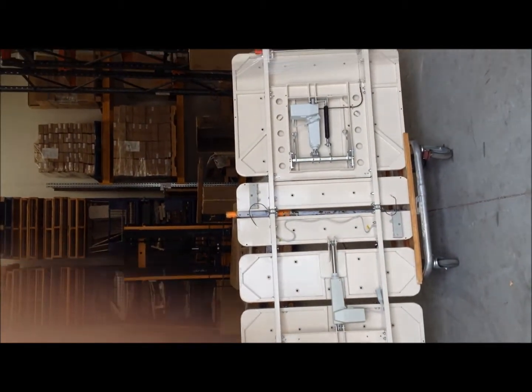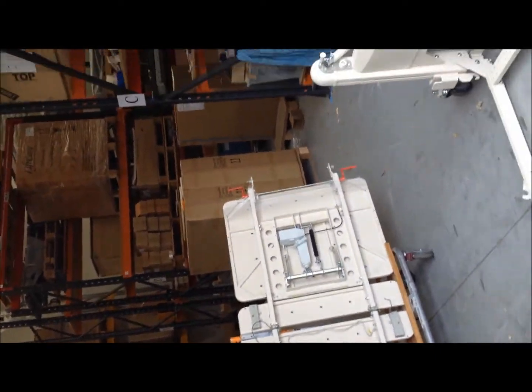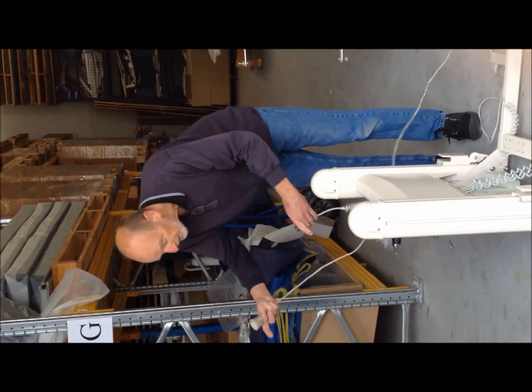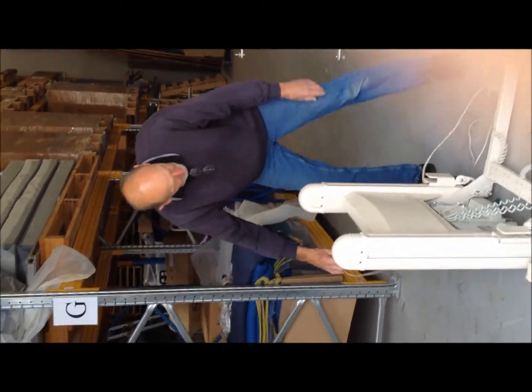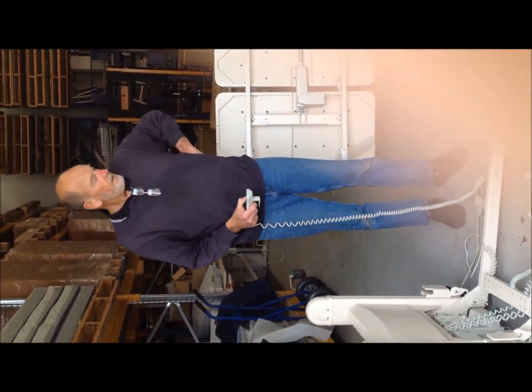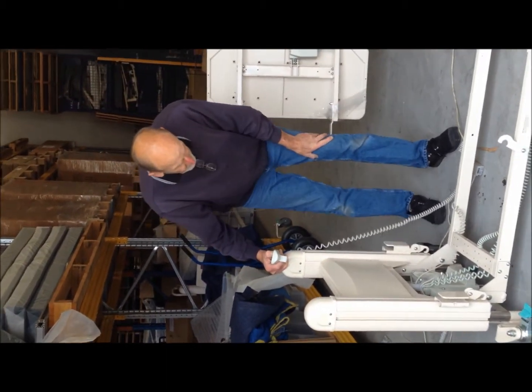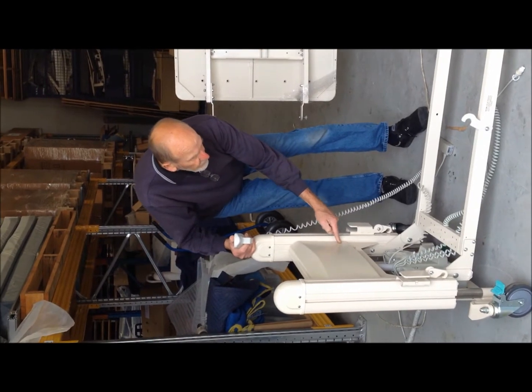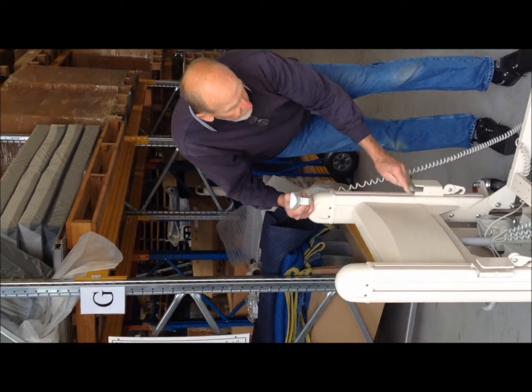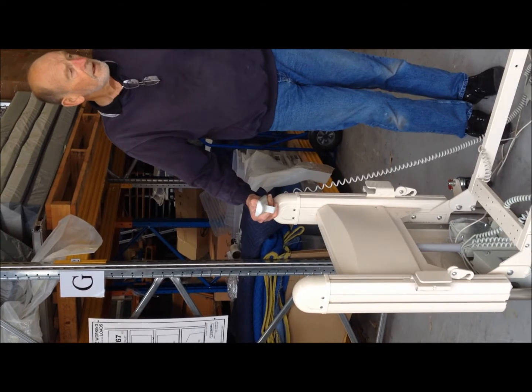I'll put the 240 volts into it. Now the bed's ready to come up to put the platform on. You don't have to synchronise anything, you just have to raise the bed up. And the most common thing is half of this level with the screws. When this comes up, midway through there, level with the screws, that's enough height that you need to assemble the bed.